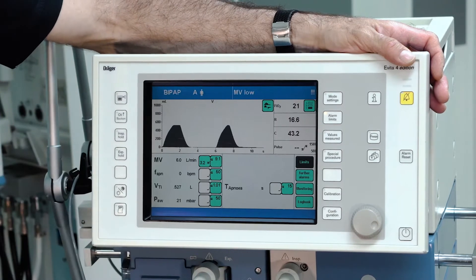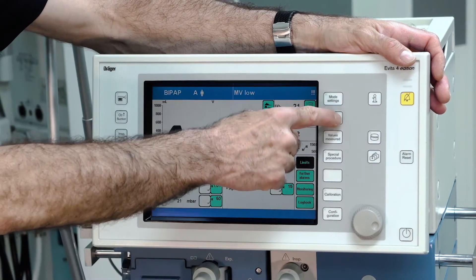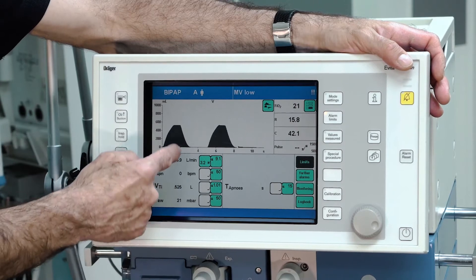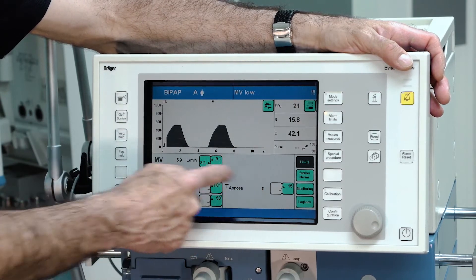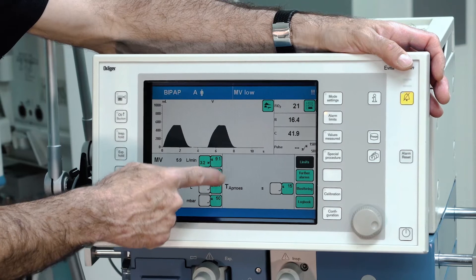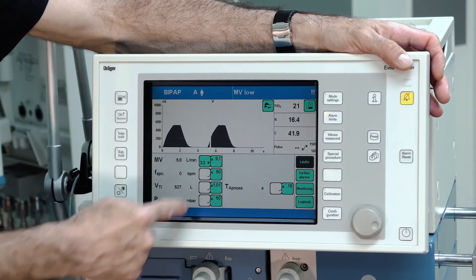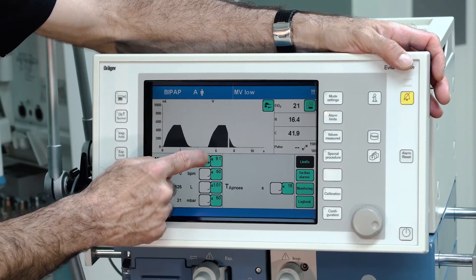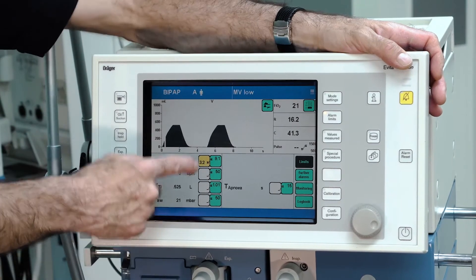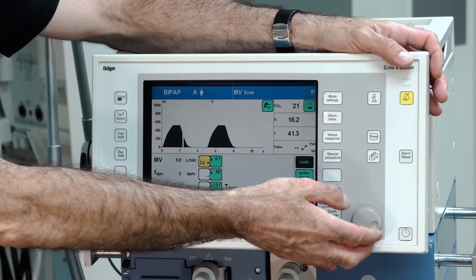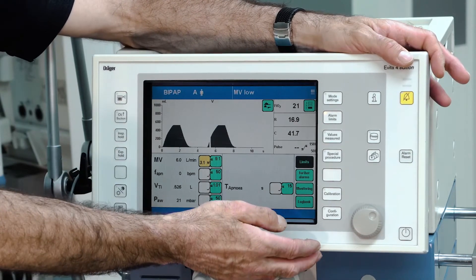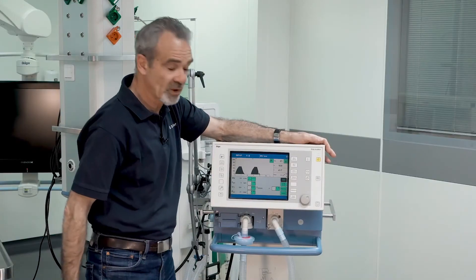Adjust your alarm limits by pushing the alarm limit button. You see the actual measured values on the left side and the alarm limits on the right side. To change a limit, just push the desired value — it turns to yellow. Change it with the rotary knob and confirm again.